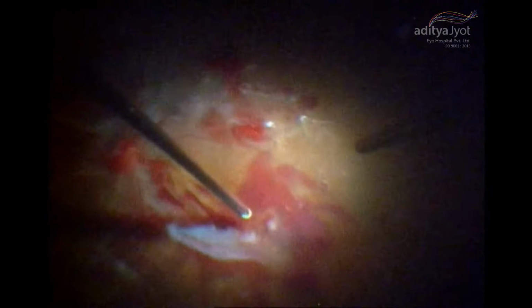Here in the vitreous machine I push fluid between the fine membrane and the retina, and this is like doing a segmentation and delamination using the vitreous cutter. And as you see here, I made sure that the posterior hyaloid is totally separated, and then you are cutting the membrane and also separating the vitreous membranes from the surface of the retina, and making sure.